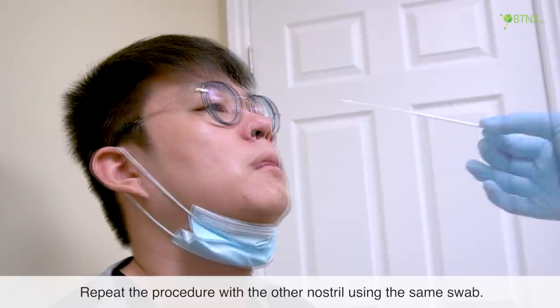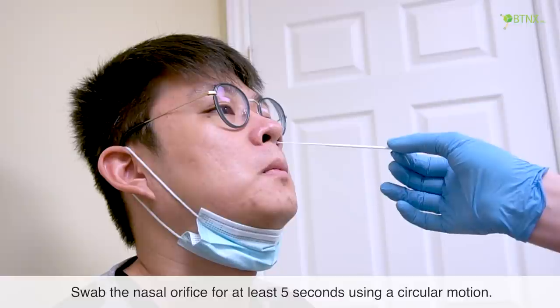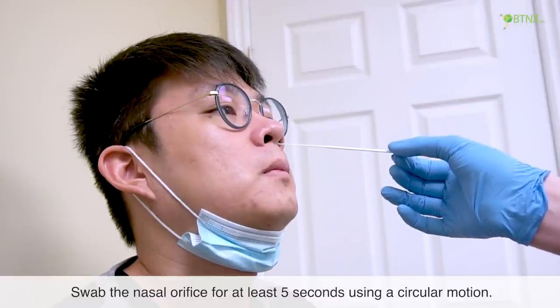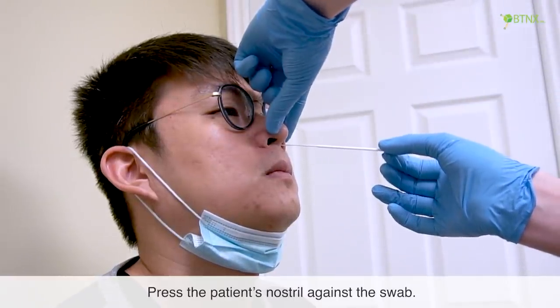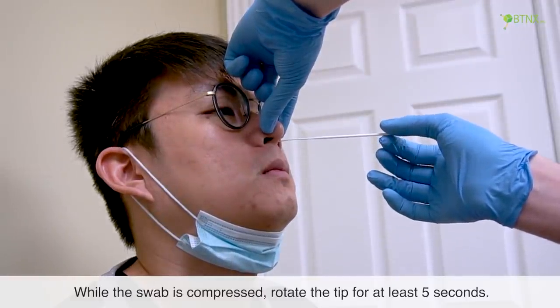Repeat the procedure with the other nostril using the same swab. Swab the nasal orifice for at least 5 seconds using a circular motion. Press the patient's nostril against the swab, and while the swab is compressed, rotate the tip for at least 5 seconds.